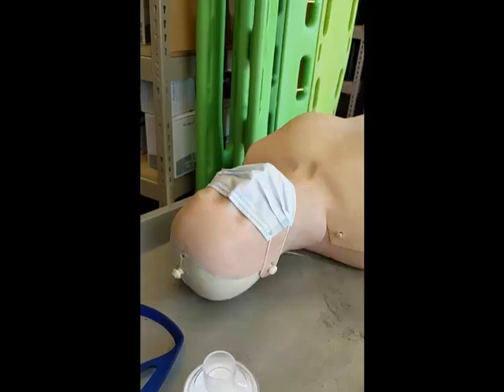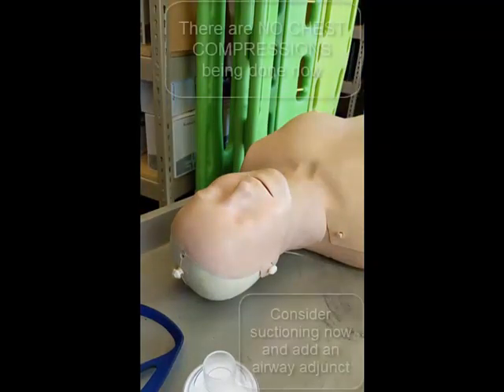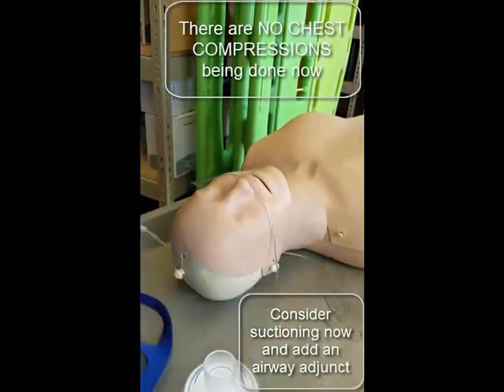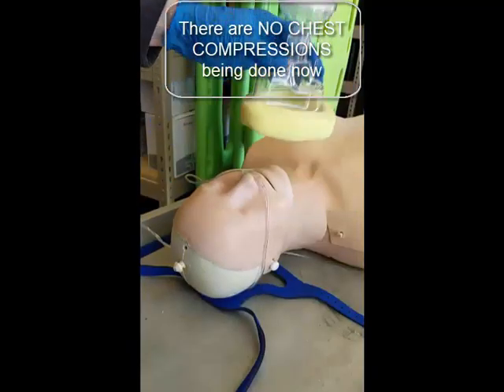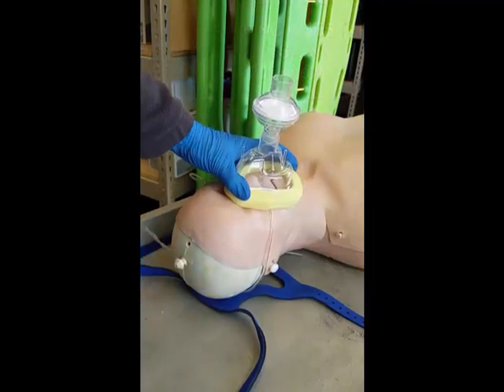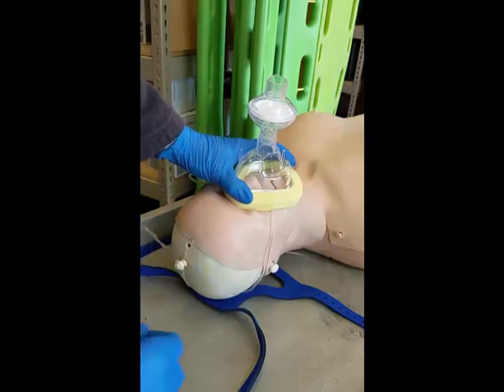At the end of the first two-minute cycle, the surgical mask is removed by the person managing the airway. The nasal cannula is very quickly placed over the patient's mouth or nose — doesn't really matter. Place the harness of the CPAP device and immediately place the CPAP mask with the viral filter back over the patient's face. That should take all of five to seven seconds, which is the time that chest compressions will be interrupted and minimal aerosolization is taking place.